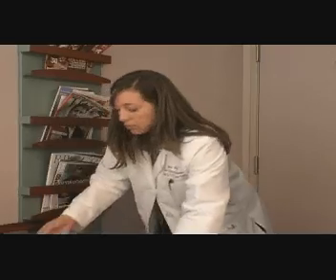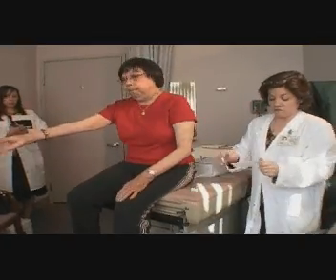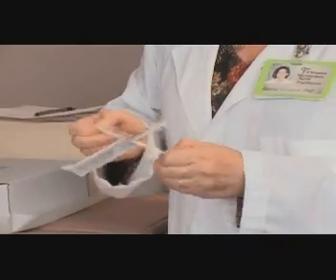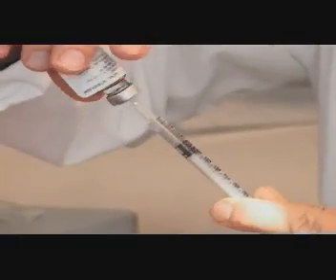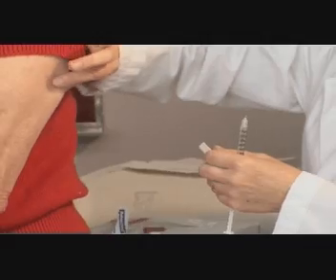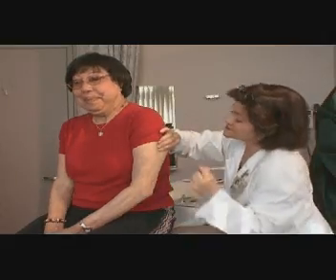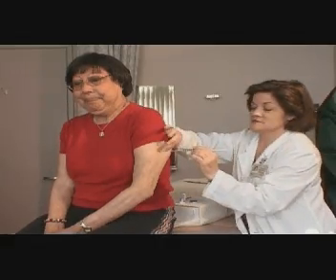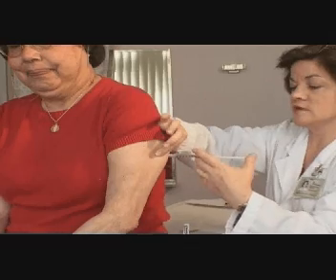On the first day of her trial, Hope receives her first injection at the hospital. I've got this little syringe. She's also shown how to handle and store the actual drug. Is it one mil total? Yes. Usually there's a little extra skin in the back of the arm. Are you ready? Mm-hmm. So, a little pinch — and it's sub-Q, so it goes under the skin.